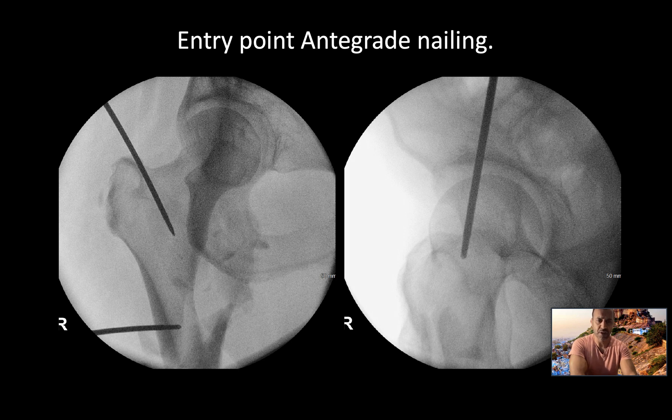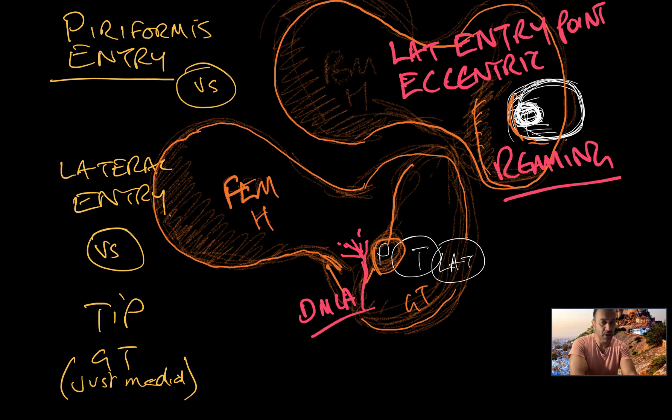I go for an entry point which is medial to the tip of GT and centered on the lateral view, and I sometimes use a guide wire to correct my rotation so that I get a good AP view. The reason why I go for a tip of GT entry point is because when you end up more lateral, the bone is softer and you get a lateral eccentric reaming of the proximal femur, leading to a more lateral position of the femoral nail and more likelihood of a varus deformity. Just medial to the tip of GT is a safe area to go. It's not quite piriformis, so you're not going to affect the blood supply hypothetically.